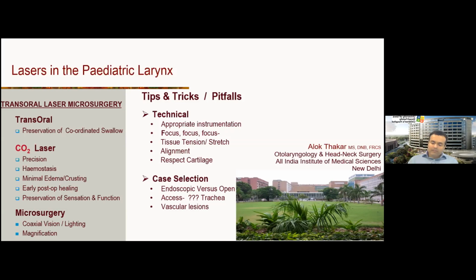What the ultra pulse mode does, it actually is generated by radio frequency. So it's a pretty high frequency laser. So you're getting pulses very rapidly. So even with a single shot, you can cut the tissue. So that's going to avoid your carbonization effect.